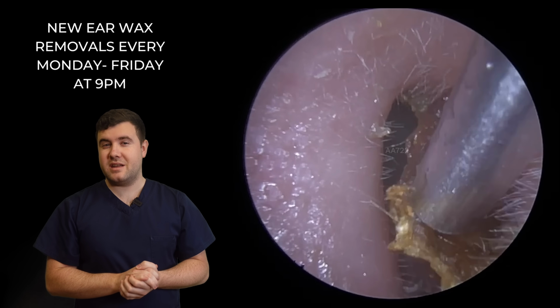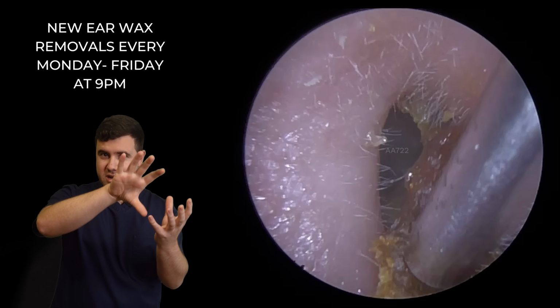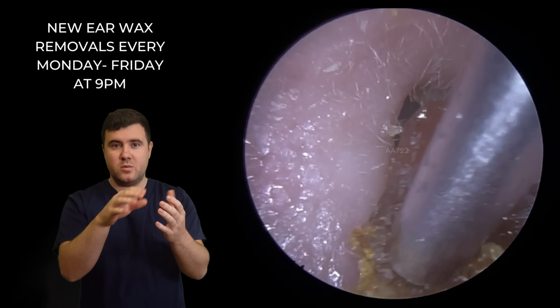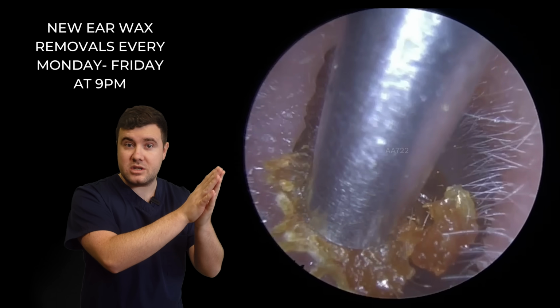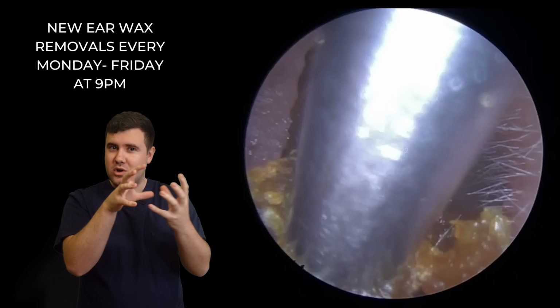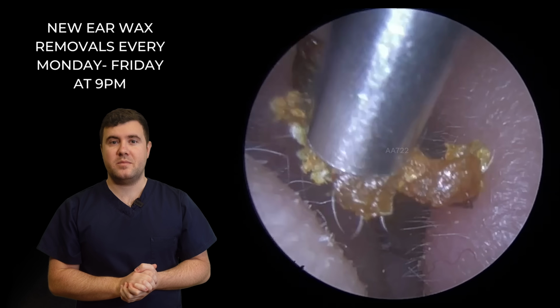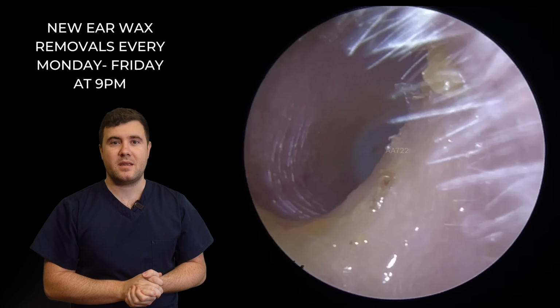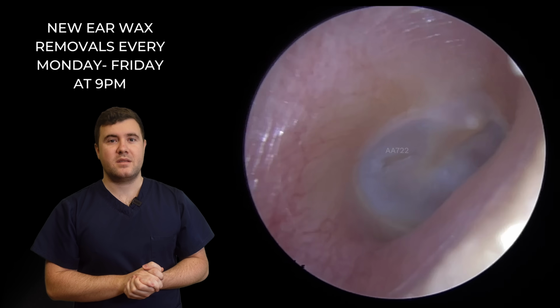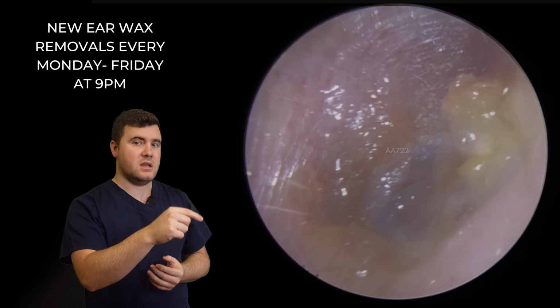There we go, I was going to say, they can be quite tricky to get hold of, these little thin bits. So we're going to try and get the angle of the suction tube so we get a flat surface on this skin, so we can actually pull it a lot easier. So we've just managed to pop this out, and you can see that long tail of dead skin behind that was holding on. And there we go, nice and clear, eardrum looking nice and healthy. That's the before shot, and this is the after.